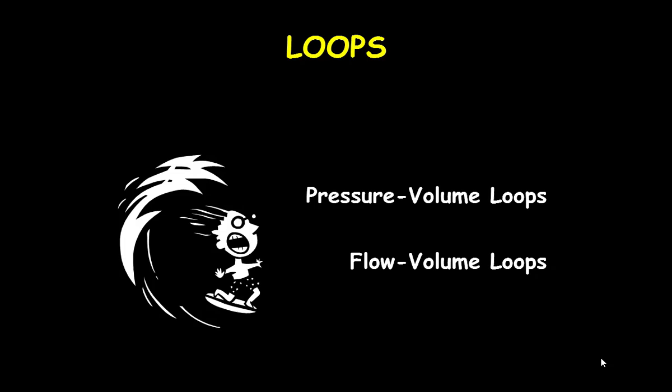Now coming to the loops. The loops are against volume. Scalars were against time, this is against volume. Pressure volume, flow volume.